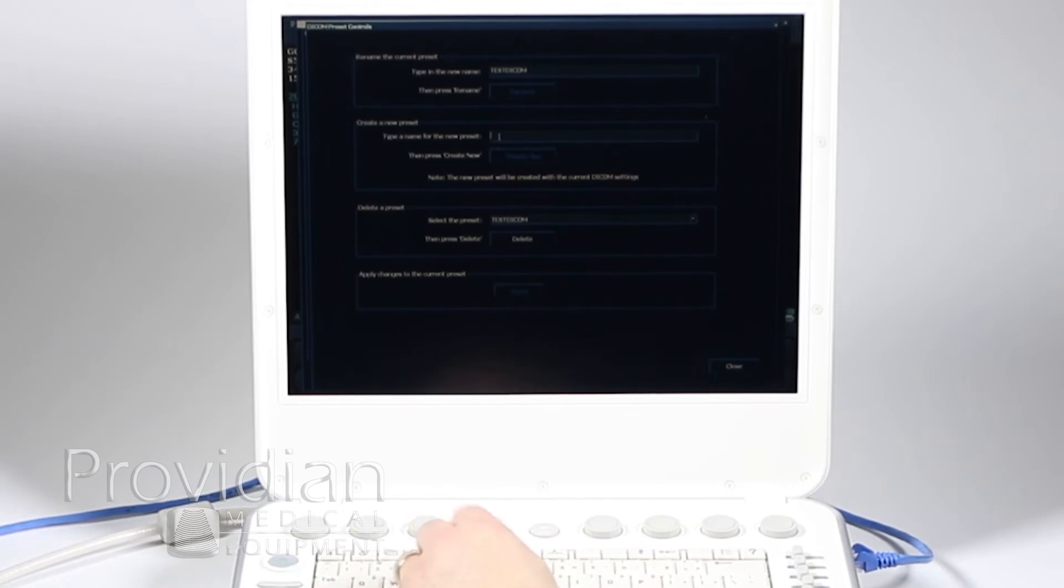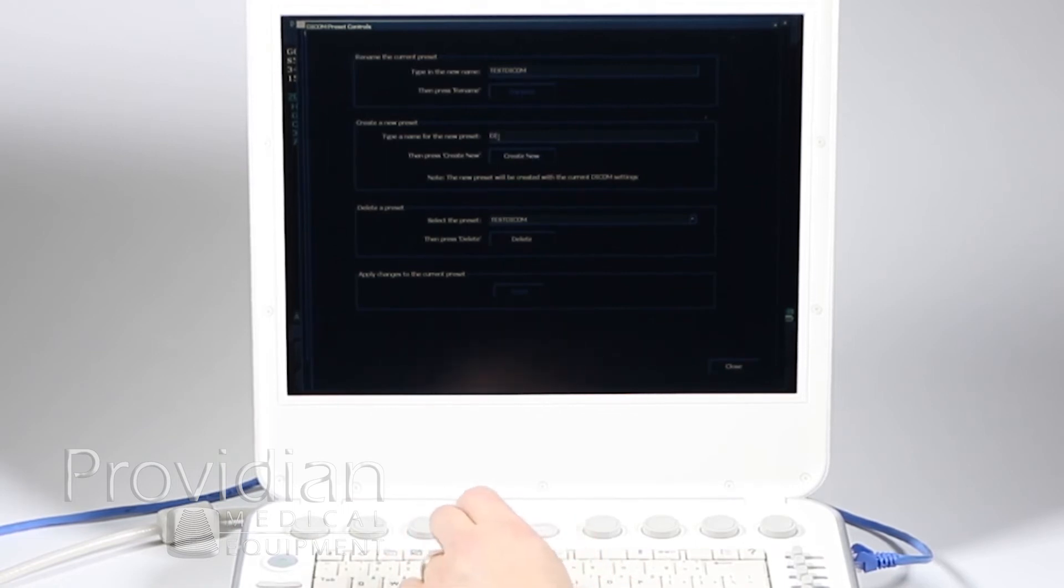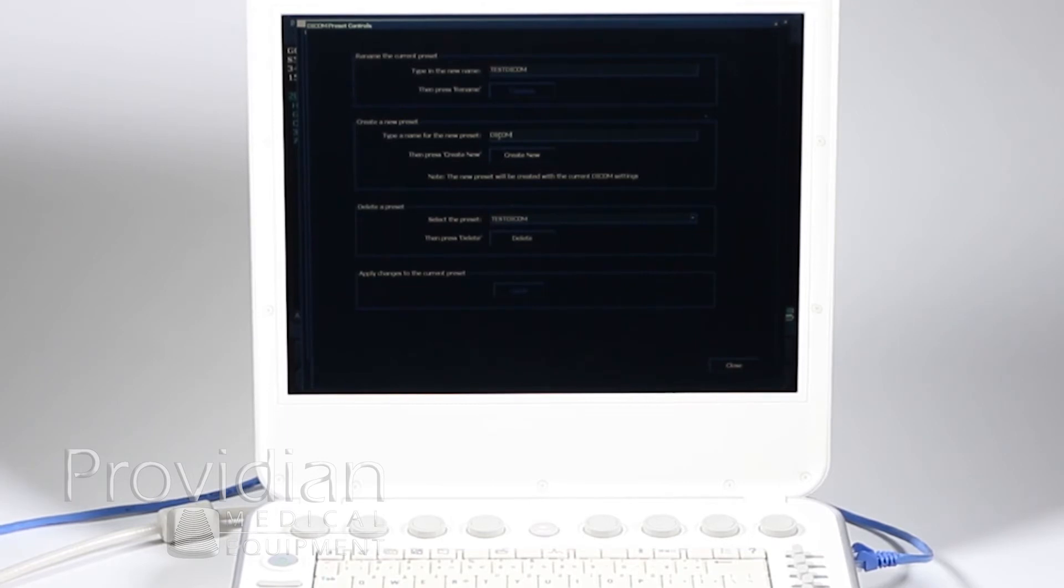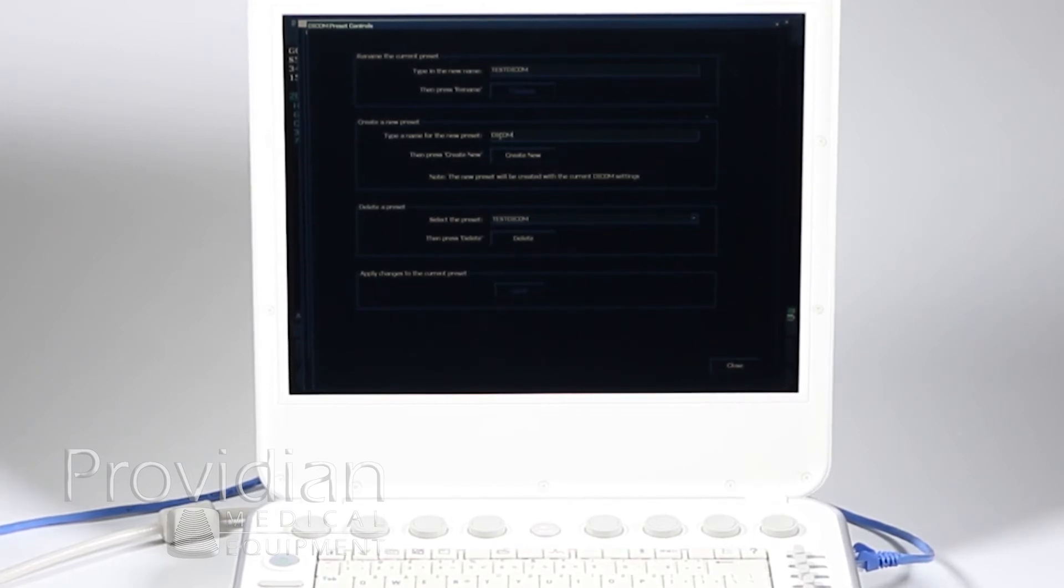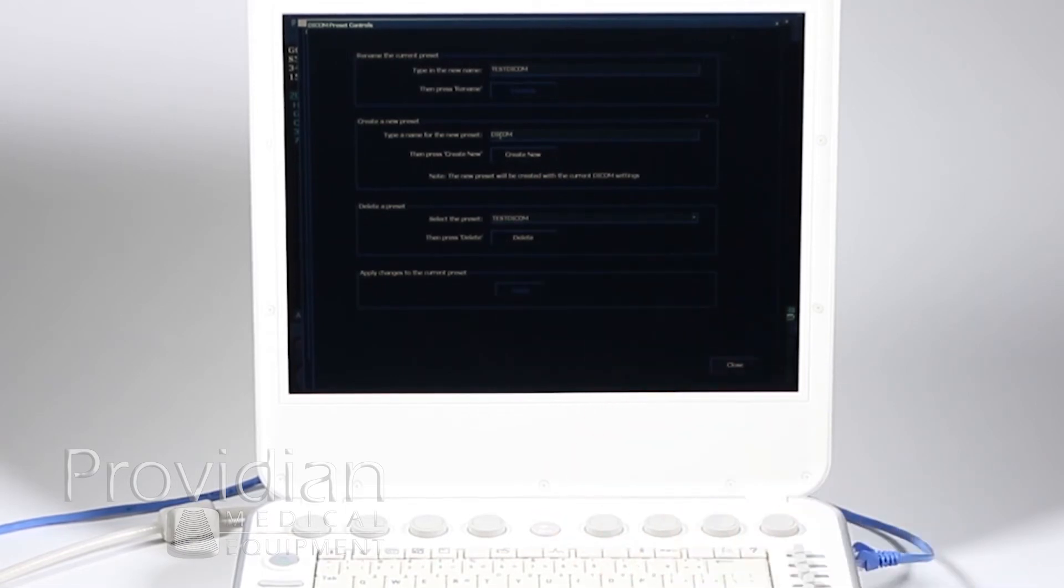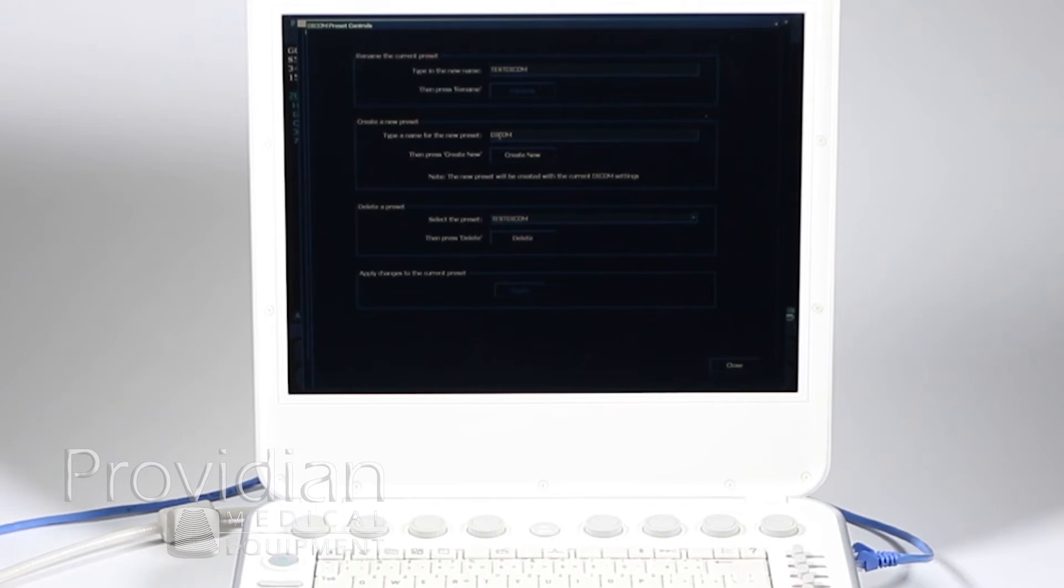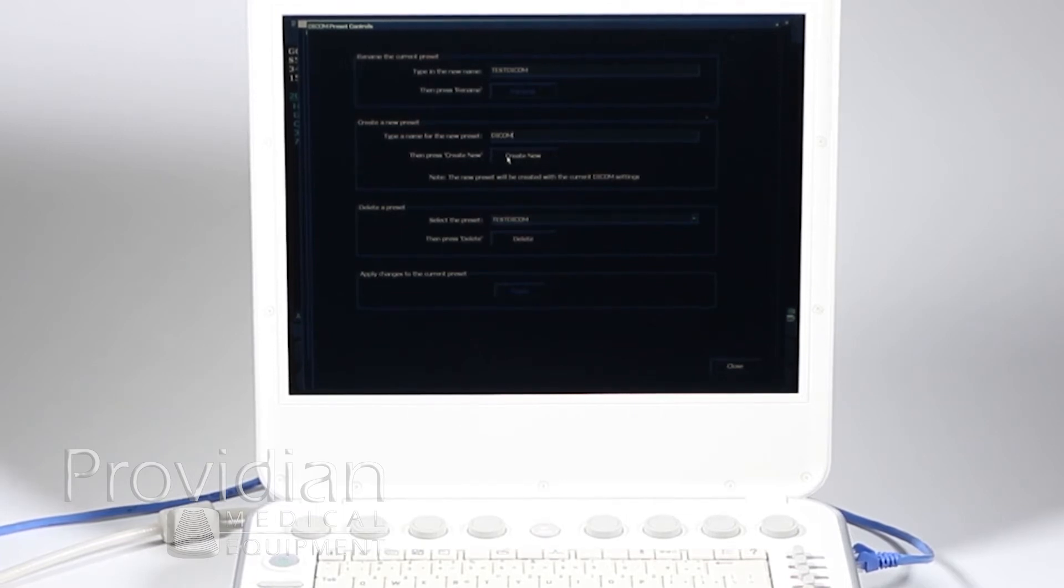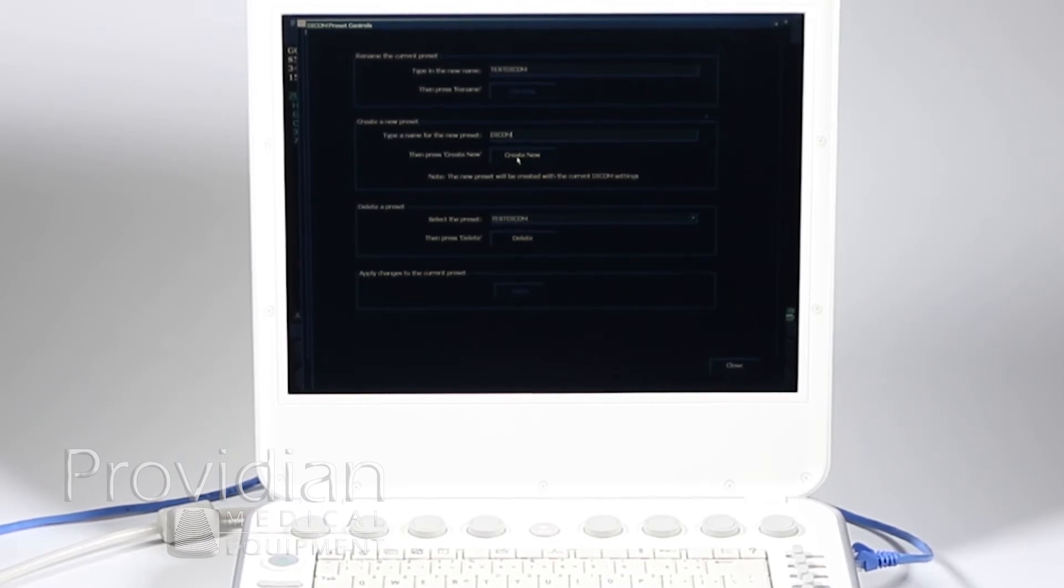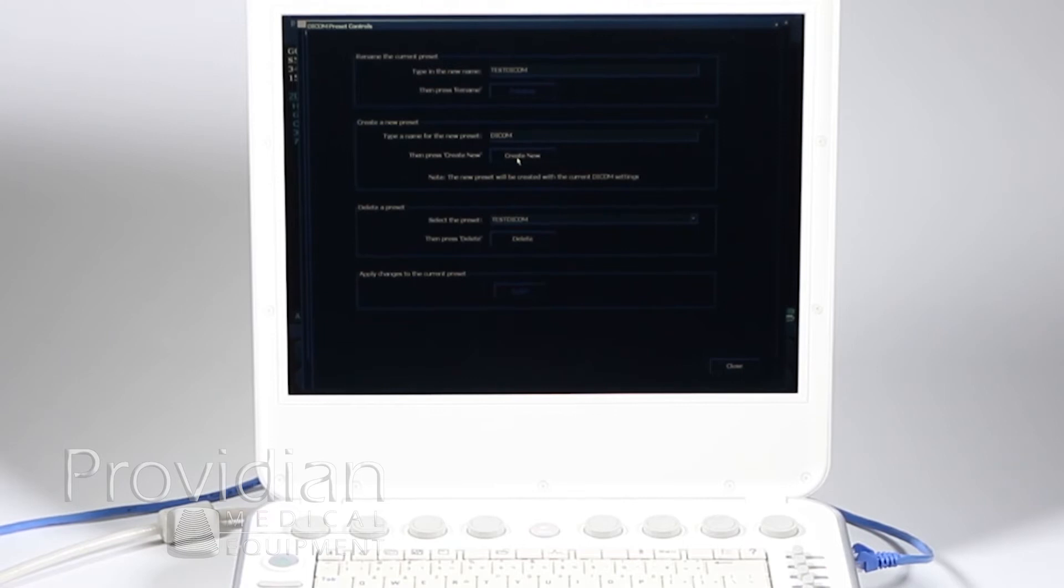I'm just going to write DICOM. Typically, you're going to want to name something specific, like your PACS system. You know, if it's called iCloud PACS or something like that, you'll want to put that in there. So when you select to export, you'll know what it is. By the way, if I want to delete a previous one, I can do it here, but it requires at least one to be in there. So we'll go ahead and create new.